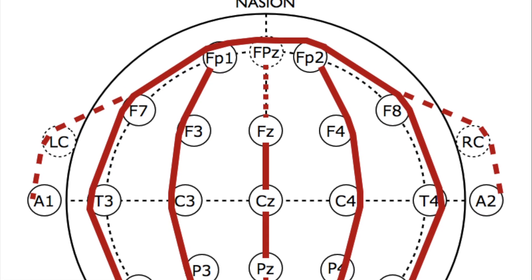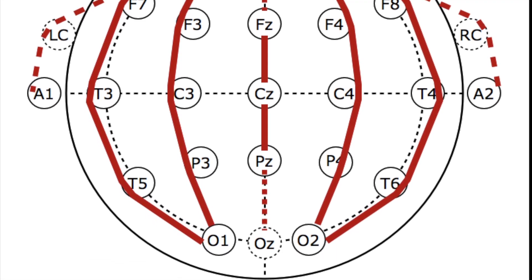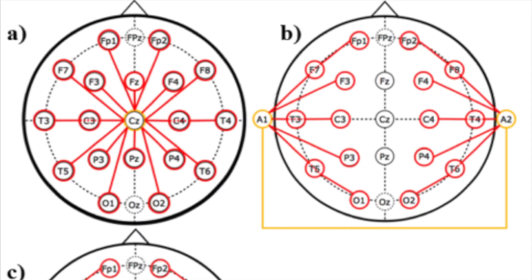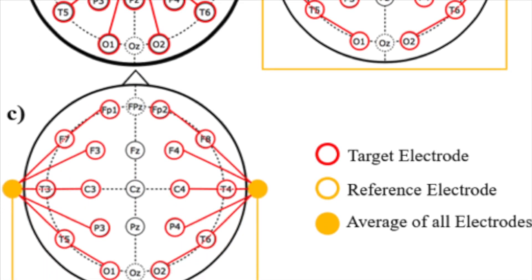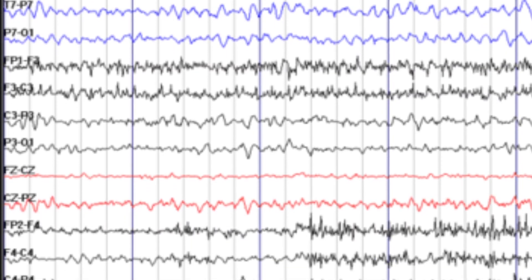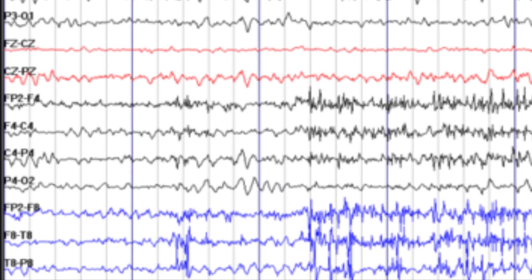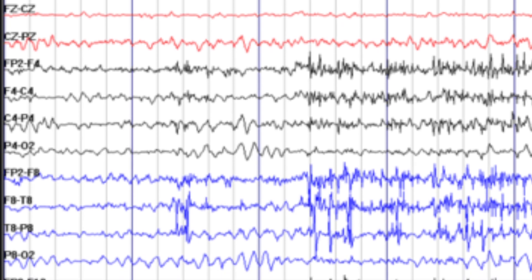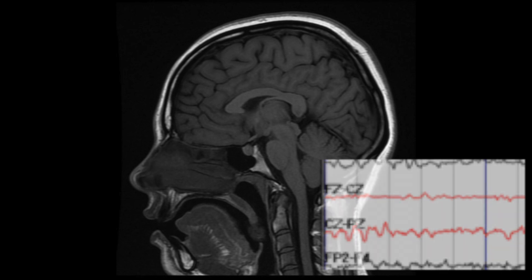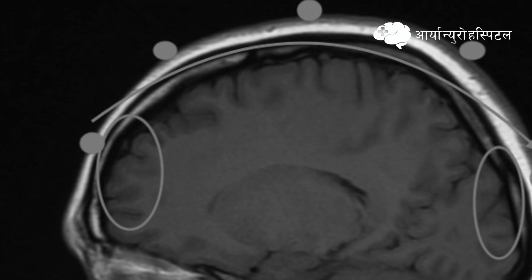The first thing to look into the EEG is the montages — how the EEG leads are arranged, whether it is anterior-posterior bipolar montages, transverse bipolar montages, or average referencing montages. They are arranged to give us functional images of the brain. In an anterior-posterior bipolar montage, we can see the sagittal and parasagittal functional images, arranged sequentially from the left temporal, left parasagittal, central, right parasagittal, to the right temporal sequence.